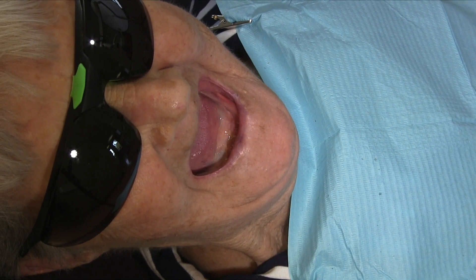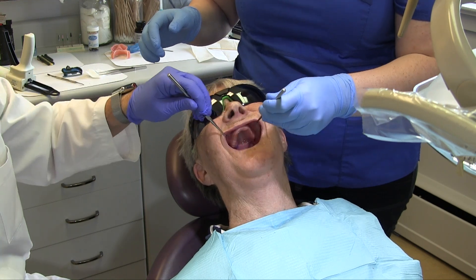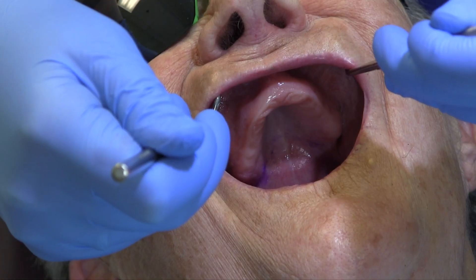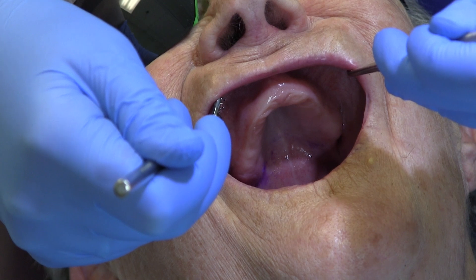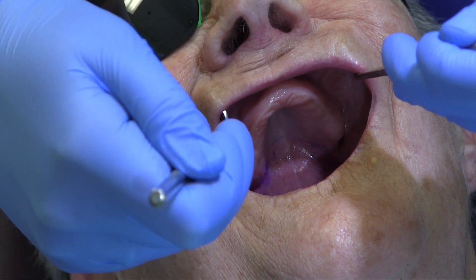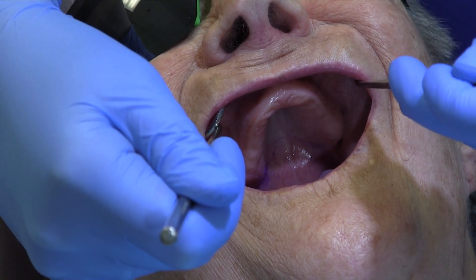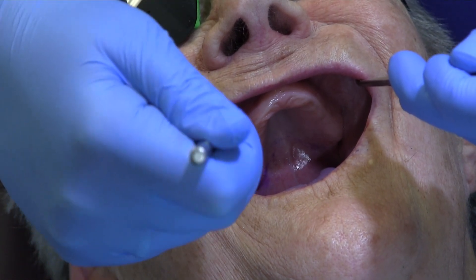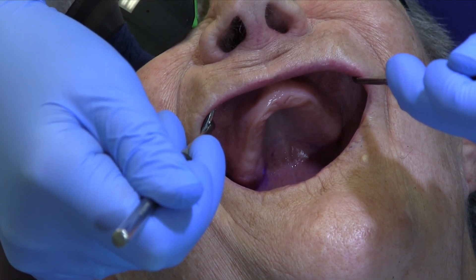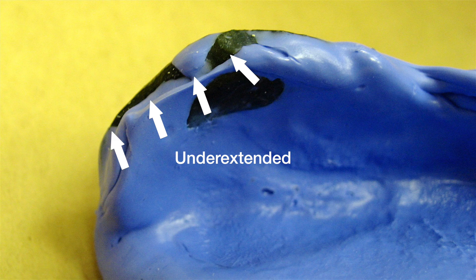Begin with the clinician and an assistant, each with a mirror. Place the mirrors at the location of the canines and retract the lips and cheeks by moving the two mirrors until both the anterior and posterior vestibules are visible at the same time. By exposing the vestibular fold, impression material is able to flow to the depth of the vestibule without trapping air. This minimizes the possibility of voids or underextensions in these critical areas for denture retention.